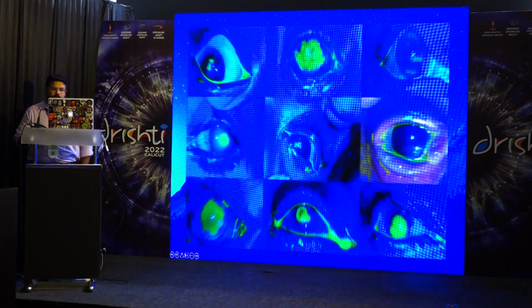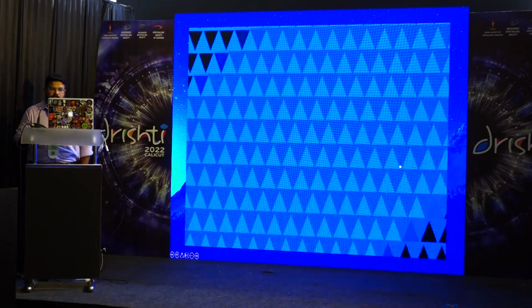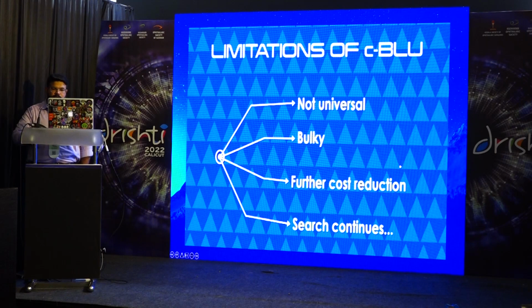So we captured good quality cobalt blue images of various corneal pathologies, but it had limitations. It was not universal. As you could see, it was bulky. And we had to reduce the cost further, and so the search continued for a better version.